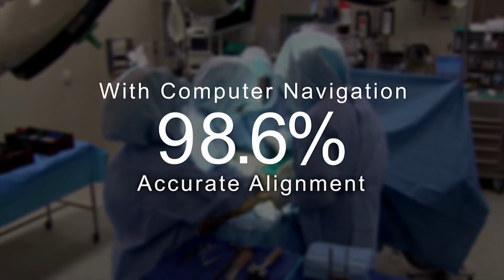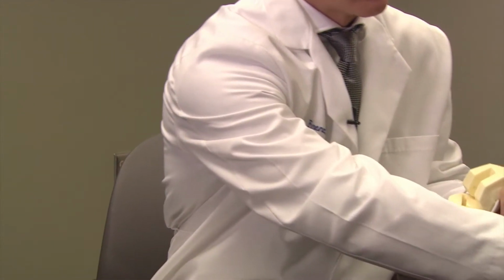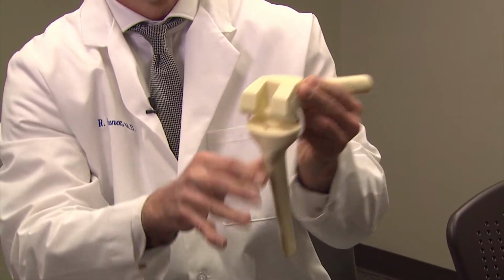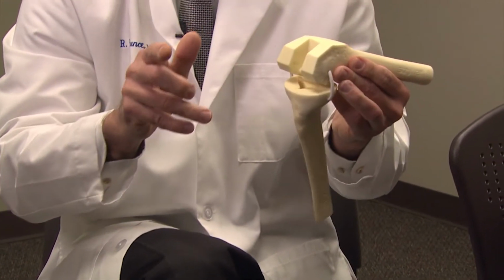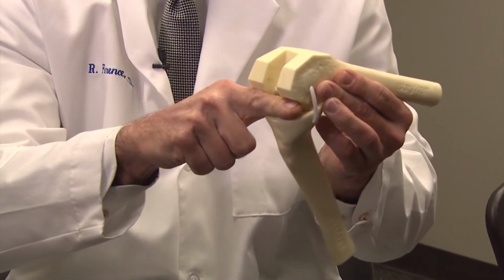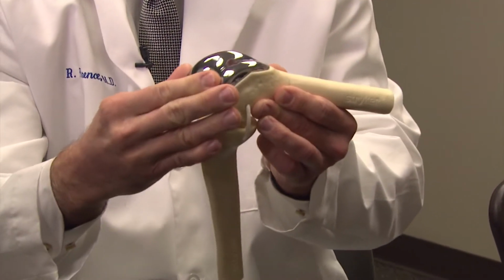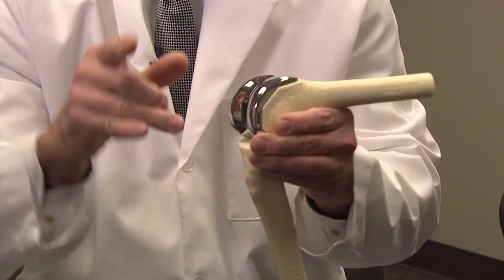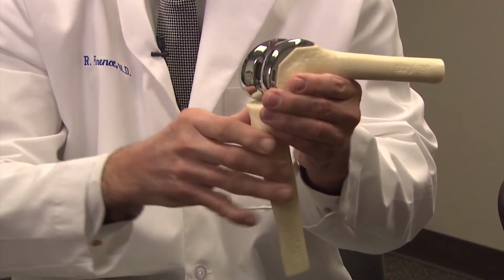In a knee replacement, what we basically do is, here's the thigh bone, and here's the shin bone. So it would sit like this. So it's actually a very bone-preserving procedure. We just take little wafers of bone off the end of the thigh bone to reshape it. We cement on a metal cap, and in the cement I put two antibiotics, vancomycin and tobramycin, which will leak into the joint for 9 months to prevent infection.